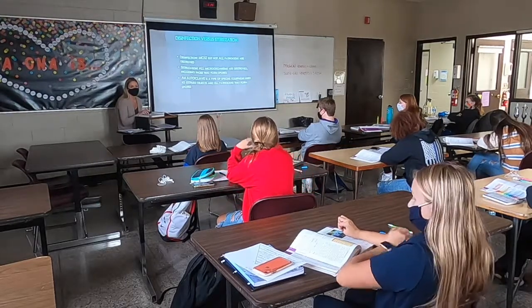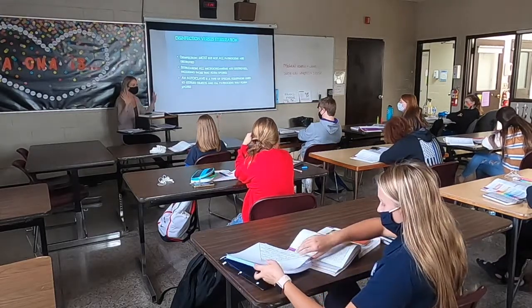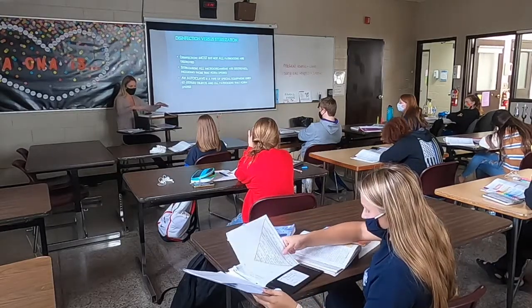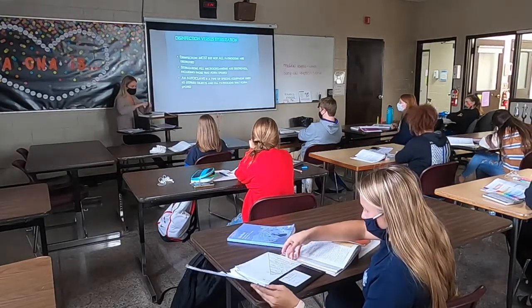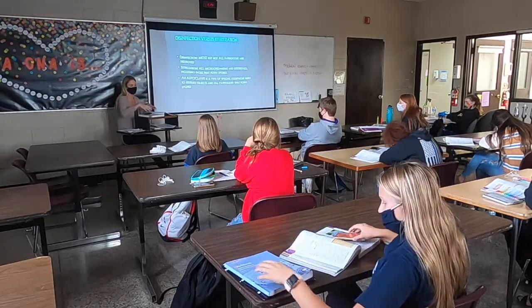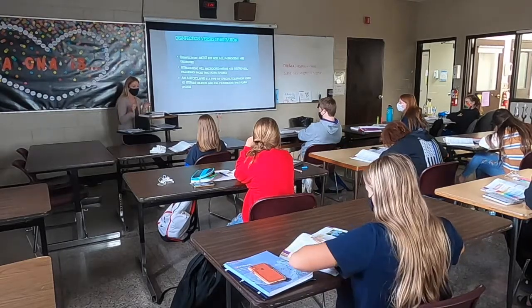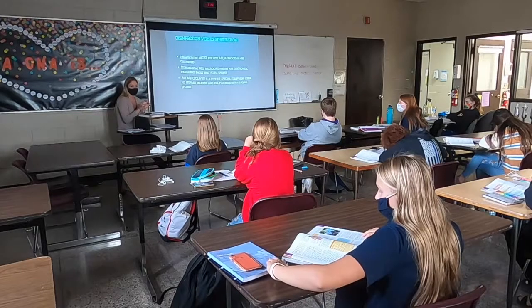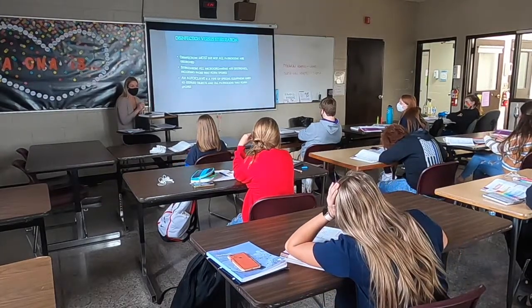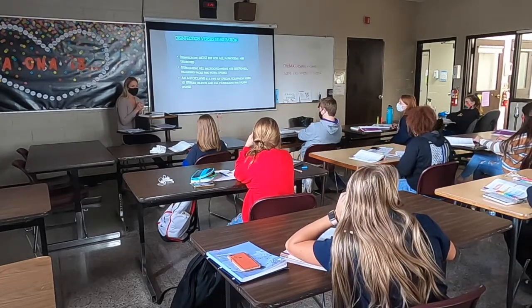Urinary catheter. When a nurse places a urinary catheter, that is a very sterile procedure. She has to wear sterile gloves, and he or she has to have the whole packaging that you open. Everything within a urinary catheter kit is all sterile, because we're putting a tube up the urethra, right? What happens if we break that sterile field before we put that tube up there? What could we cause? Infection. Urinary tract infection. Not good.